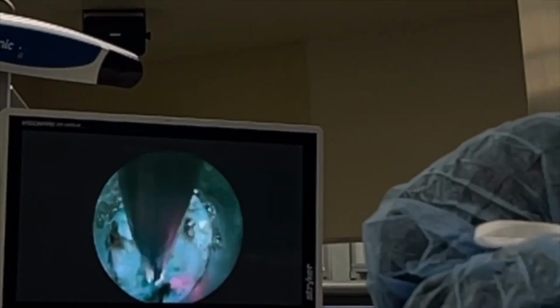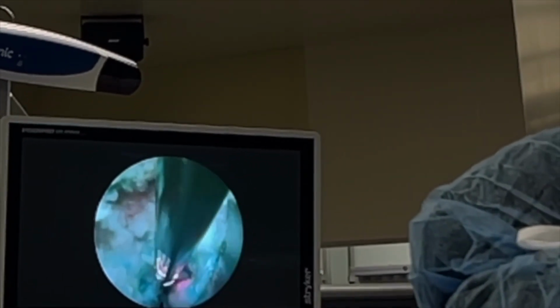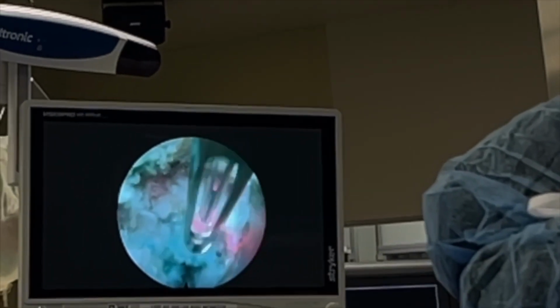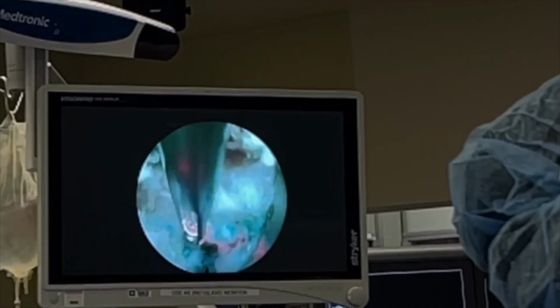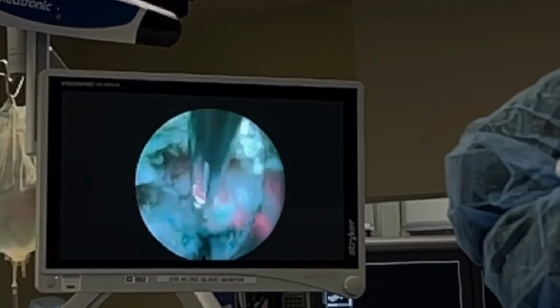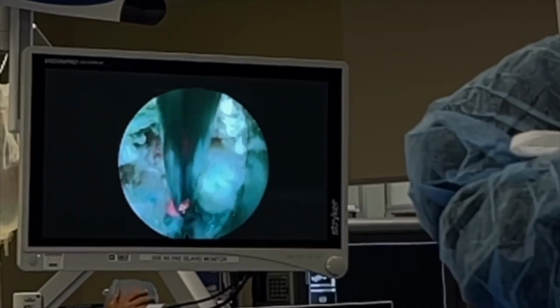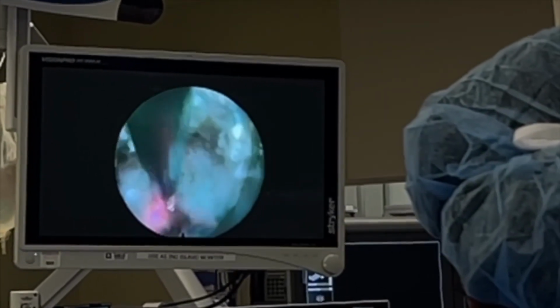Ready, Harold? Okay, this is the side-firing holmium laser. This is one of many tools that I use, but this is the sexiest tool. It's firing sideways. That red light is just the red light that you see on your pen. It's just the pointer. The holmium laser is actually invisible, I think, unless you're a dog or an eagle or something and have special eyesight. But look how things just get vaporized and disappear like magic.